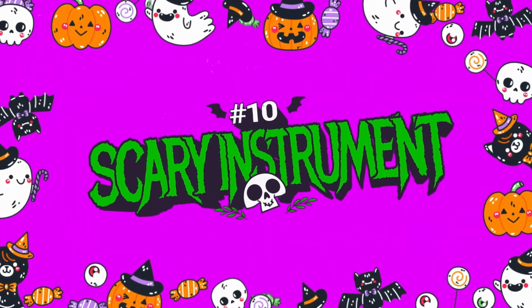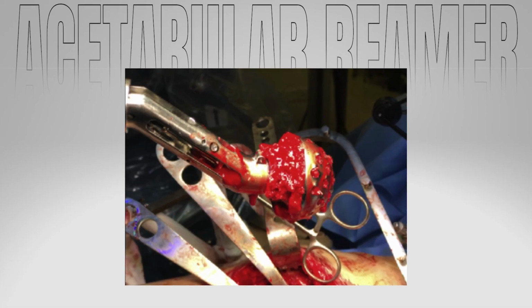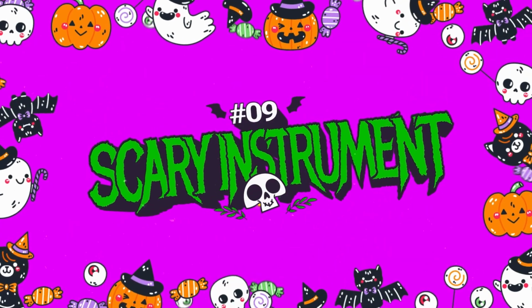Scary instrument number 10. From the specialty of ortho comes the cheese grater of the operating room, turning acetabulums into nasty mush. The acetabular reamer. These circular cheese grater looking instruments are mounted on power drills to reshape the acetabulum to prep for new hardware, creating a total hip replacement. If you've worked in decon, you've probably come across these full of nasty, bloody scraps of bone. Yuck.